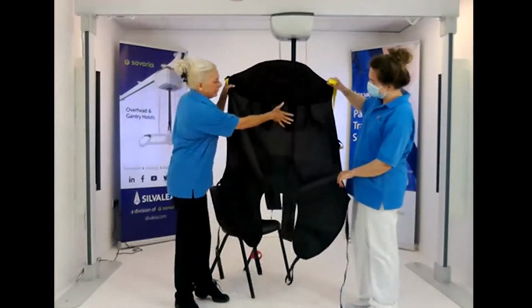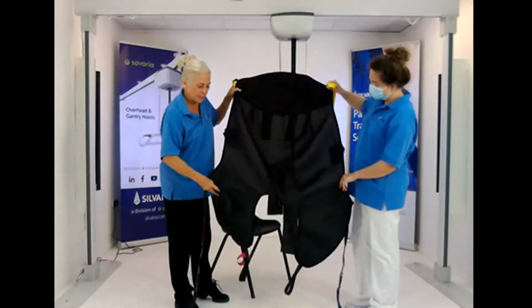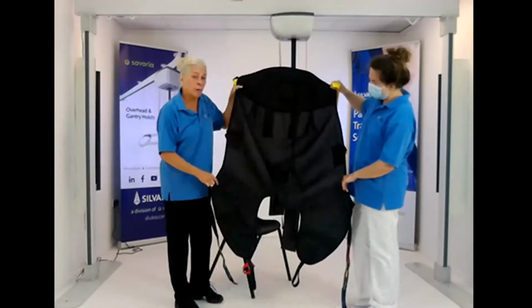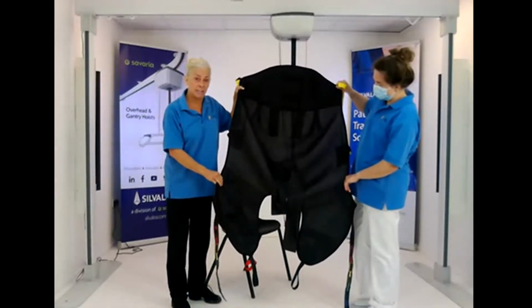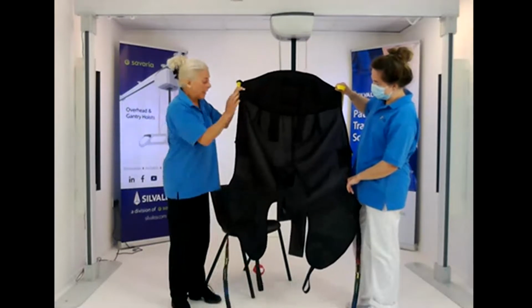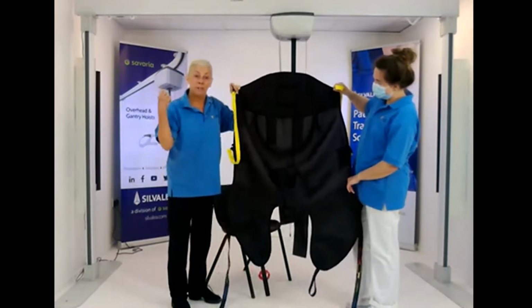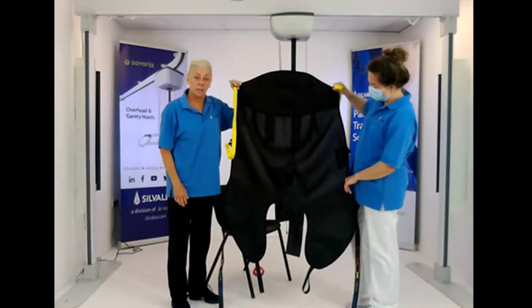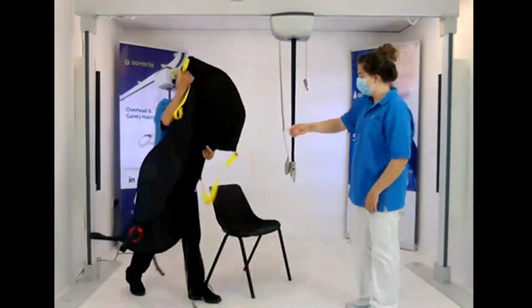It's quite hooded. It's got a little waist support built in and leg sections that come through that sort of almost deluxe type legs that wrap around the femur. So it's going to give a lot of support to each femur. And then simply a counterbalance strap. So it means you haven't got to work out which shoulder loop to put on. So it is a fairly straightforward style.